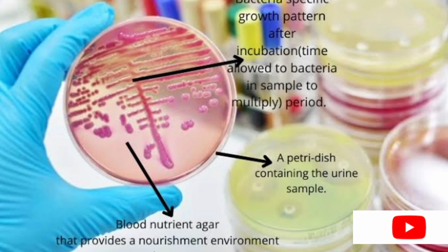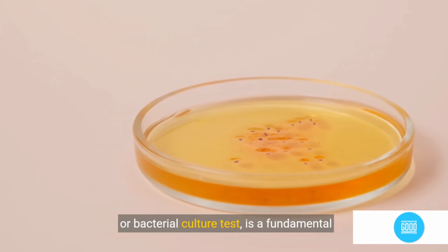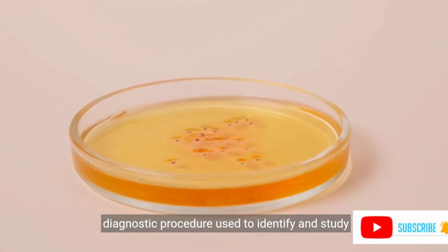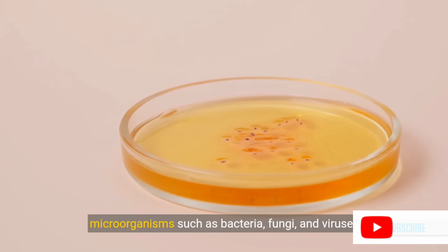Understanding the culture test, a deep dive. The culture test, also known as a microbial culture or bacterial culture test, is a fundamental diagnostic procedure used to identify and study microorganisms such as bacteria, fungi, and viruses.